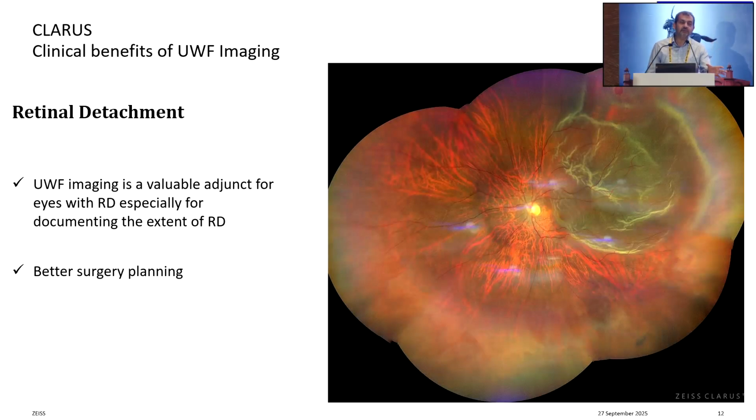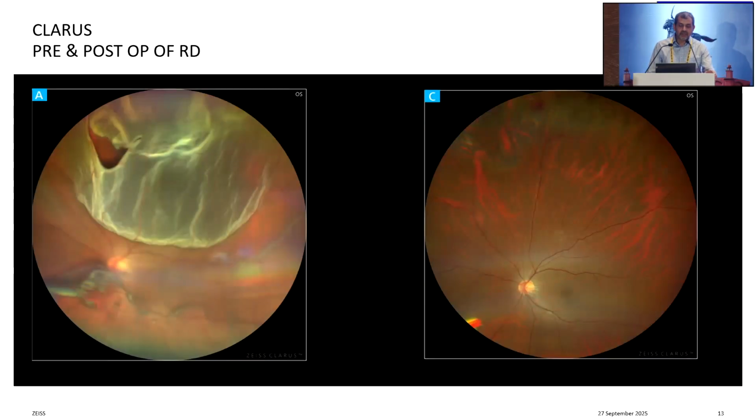Now in one image, I could plan my surgery sitting 200 kilometers away. Here again, a case of retinal detachment. You can see a beautifully captured HST superiorly, and the other image is post repair.